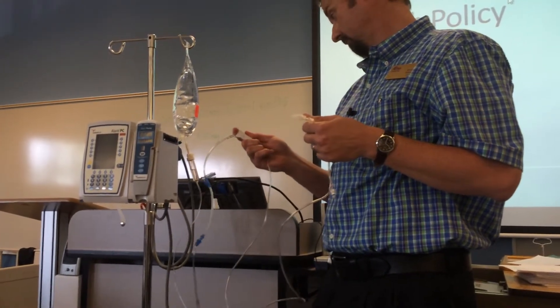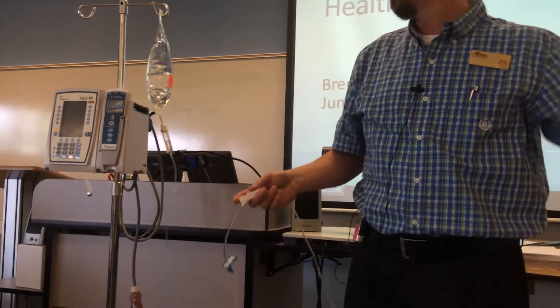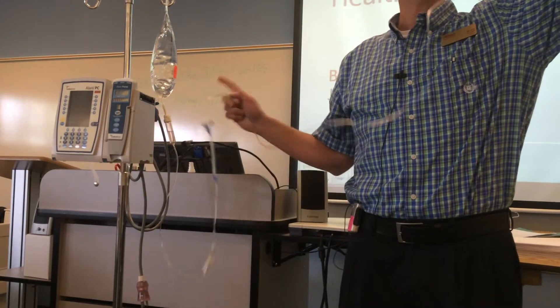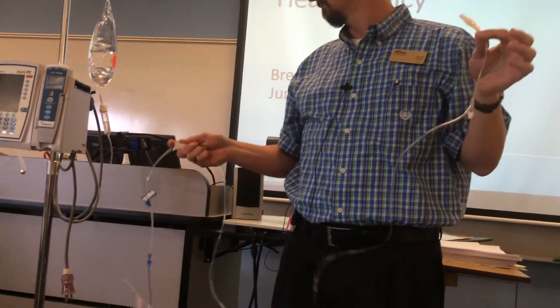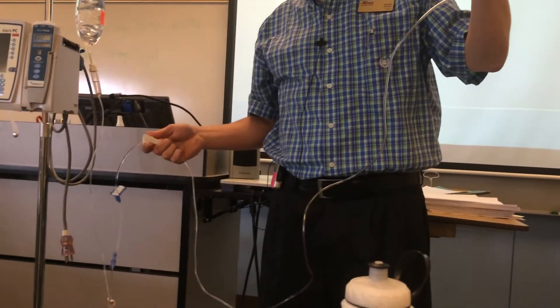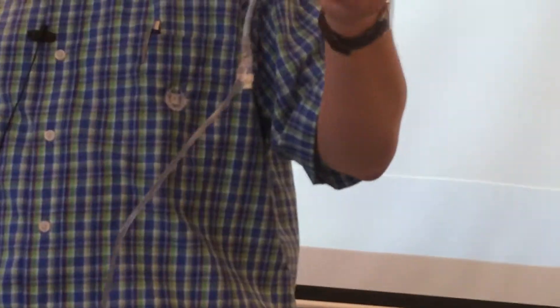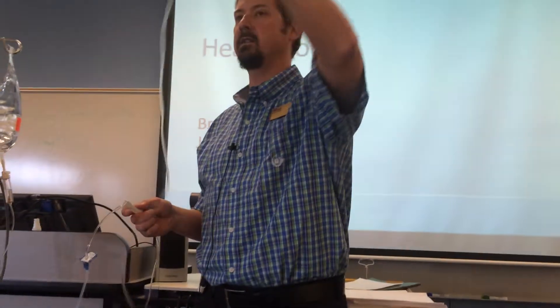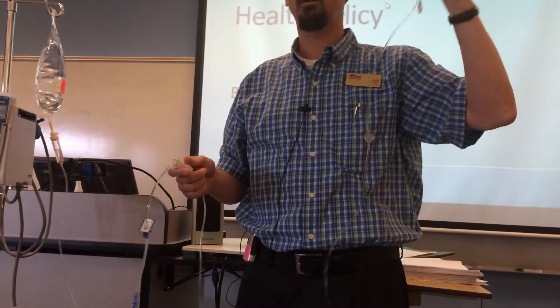I open it up and the fluid starts to go. As it comes through the drip chamber portion, I'll thump the air out. The lower I hold the tubing, the faster it'll go; if I hold it up above the bag level, it won't prime at all — so you can use that to govern your flow rate near the end along with your clamp. As it gets to the end of the tubing, I close the clamp. Now I am primed to the end of my tubing without dripping fluid anywhere, staying away from the trash can and the sink.